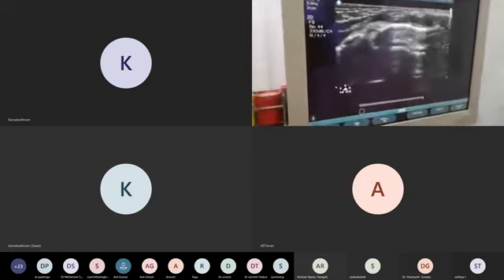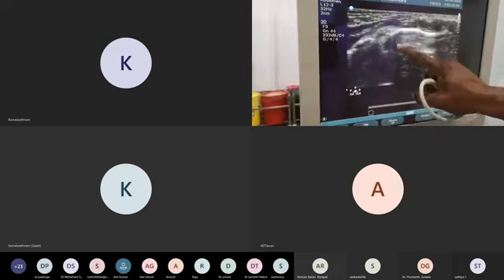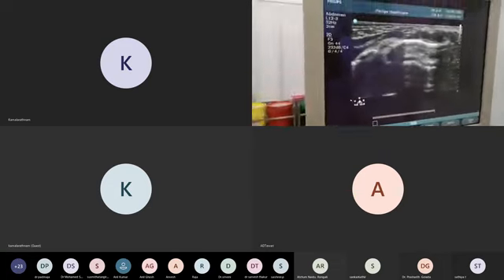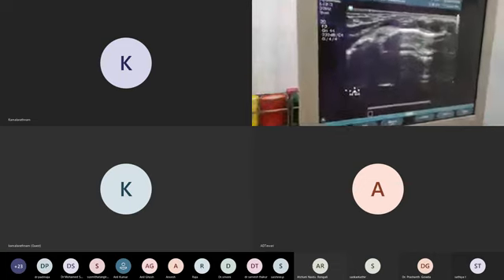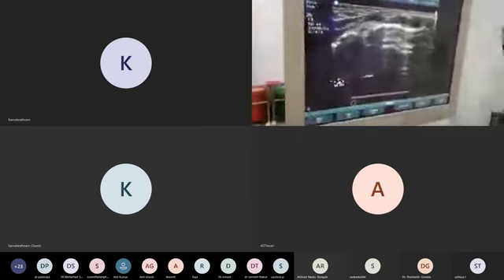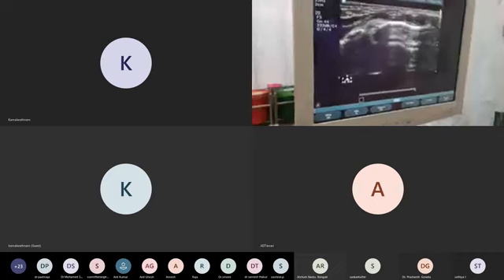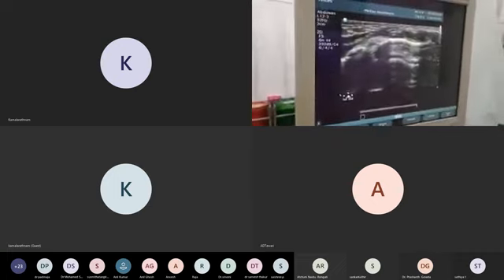In X-ray you will diagnose simple collapse or consolidation. So suppose it is collapse or consolidation, X-ray won't tell, because it appears the same. Only what is it? Trachea is pulled to this side or that side. And once again, if the deviation is little, on that side neck, it will be very difficult. I am not telling chest X-ray is outdated, chest X-ray is the gold standard. But the thing is, this is a newer one.